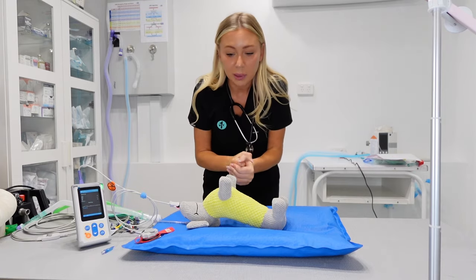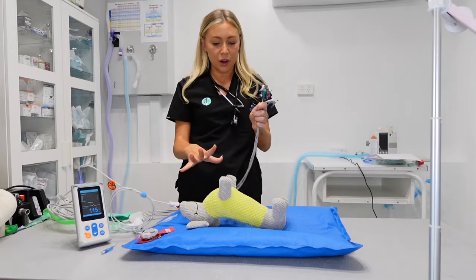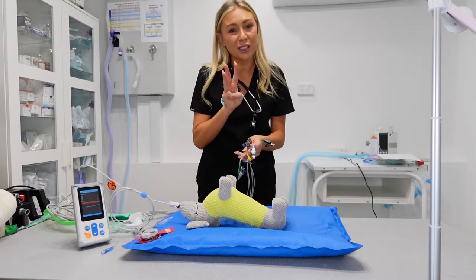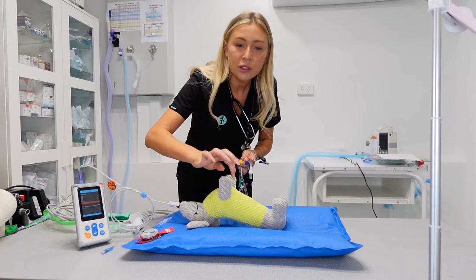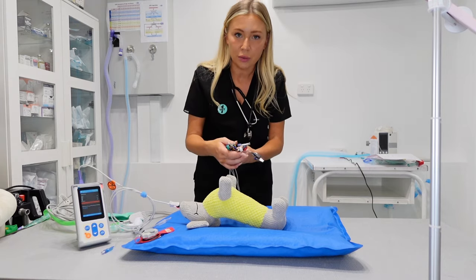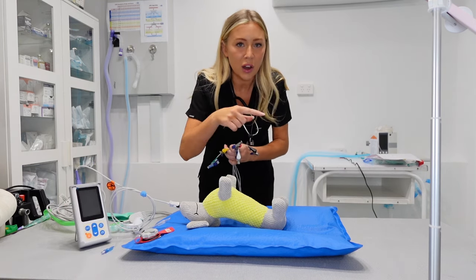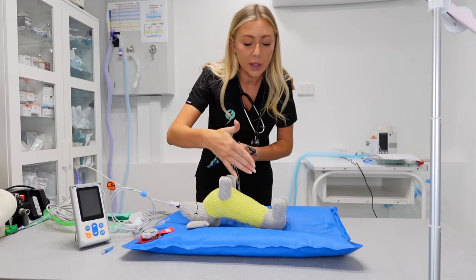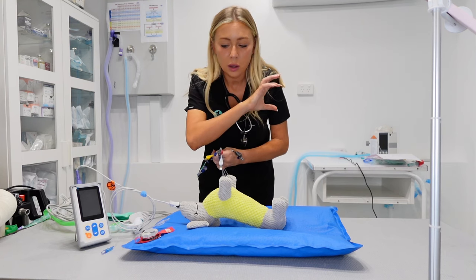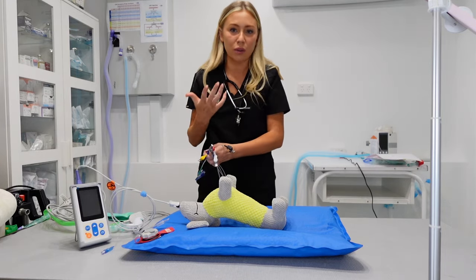Next thing I'm going to place is my ECG cords. ECG cords can definitely get very confusing — there are so many of them and it can be hard to know where to put them. Depending on the machine you're using, sometimes you only have to attach three: the front left and right foreleg, and then the left hind leg. Make sure the setting is chosen on your machine to use only three. Best practice is always to have the five cords on, but if it's interfering with your vet's cervical access, you can opt for three.